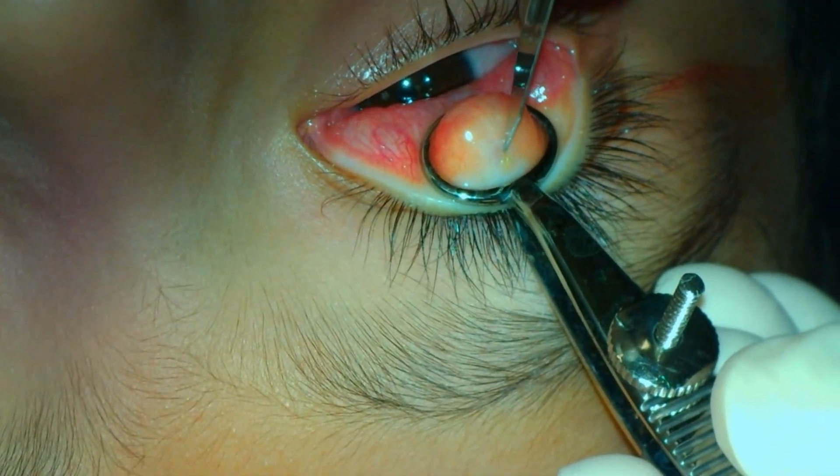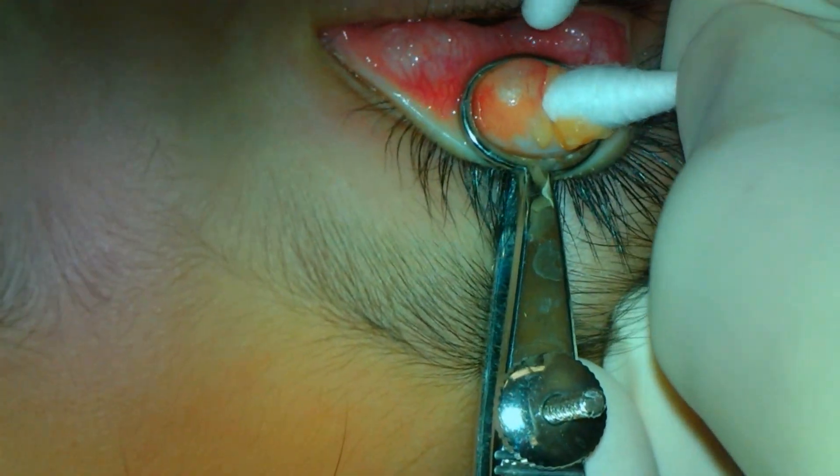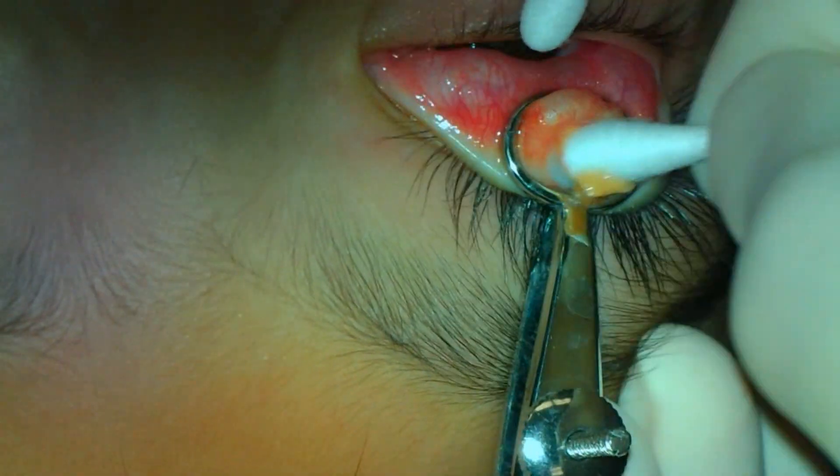The fourth chalazion is also on the lower eyelid. The 11 blade is used to make an incision over the lesion and the material is expressed.